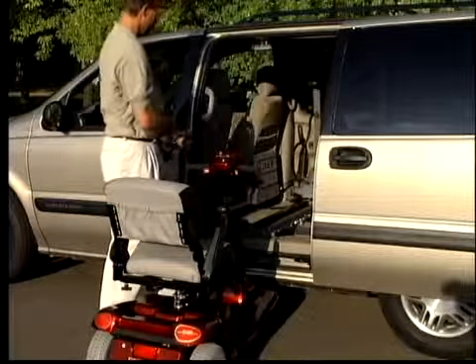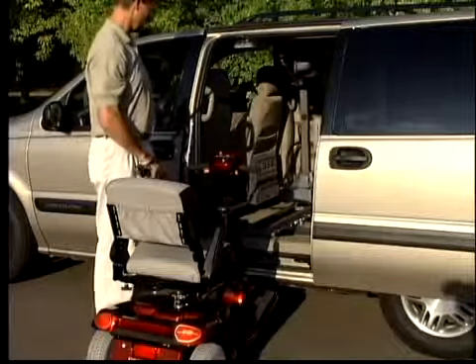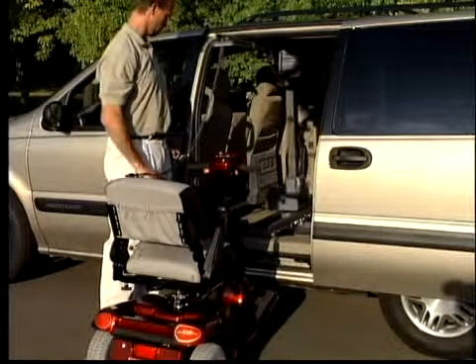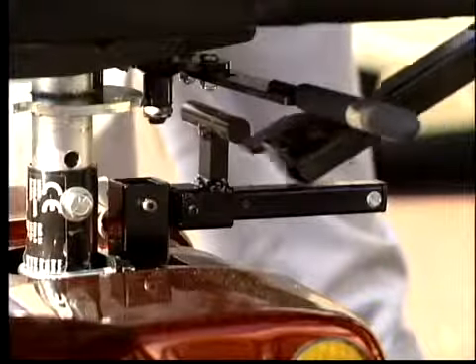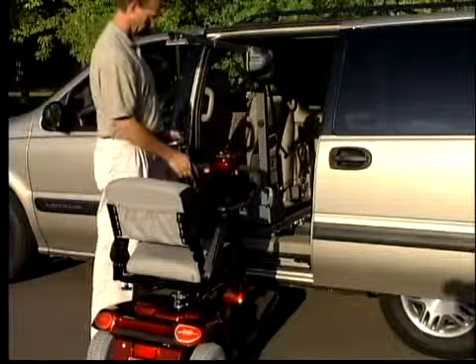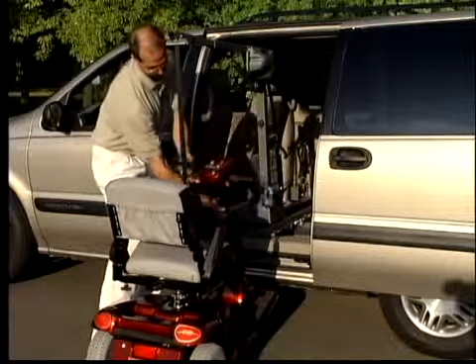To operate, press the out button to bring the lift over the seat of the wheelchair or scooter. Connect the C-arm to the docking device on your scooter. To lift the scooter, press the up button until the wheels clear the floor of the vehicle.